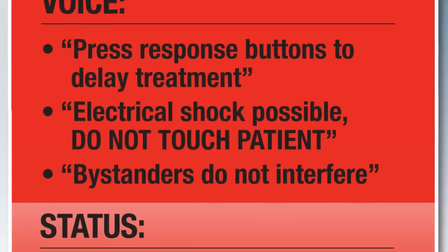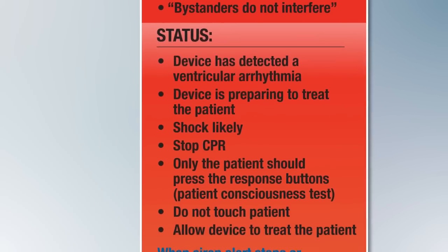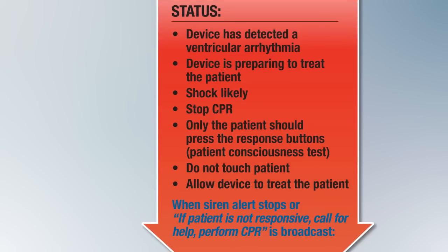When the LifeVest is in this mode, an electrical shock will be delivered between 25 and 60 seconds after the treatment sequence begins, depending on the type and rate of the arrhythmia and whether the patient presses the response buttons. Please note that you can be shocked if you are touching the patient when the shock is delivered. Do not touch the patient when the LifeVest is in this mode. Allow the LifeVest to complete the treatment sequence and shock the patient. The device will broadcast when it has completed the treatment sequence. The sirens will stop and you will hear the following instructions.